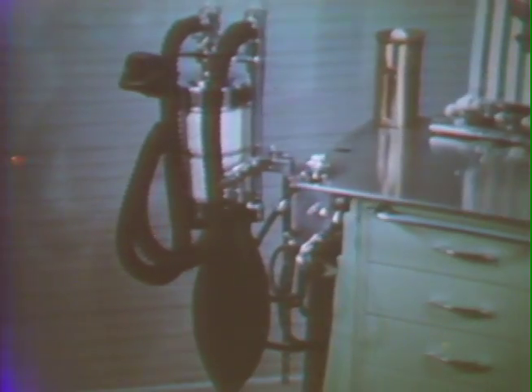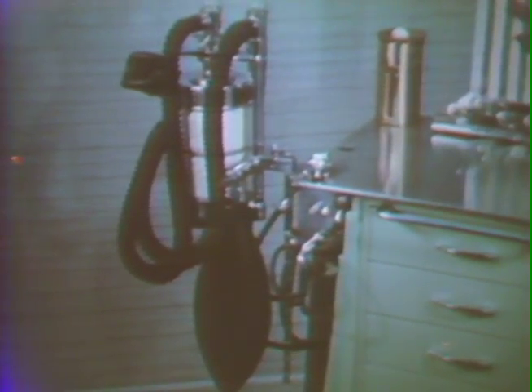Here is the copper kettle. It permits rapid, even vaporization at any given temperature and volume flow. This is the flow meter, used for metering gases to control the concentration of halothane delivered to the anesthetic circuit. A soda-lime carbon dioxide adsorber is usually employed with all of the anesthetic machines to be shown. This is a double-chambered canister.